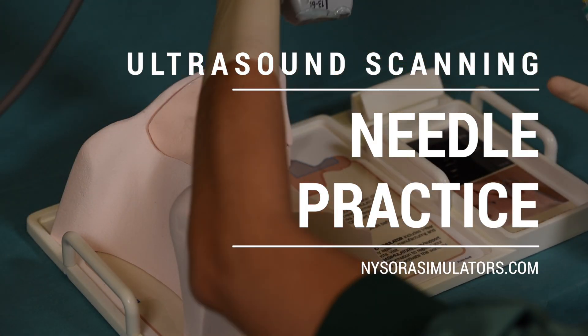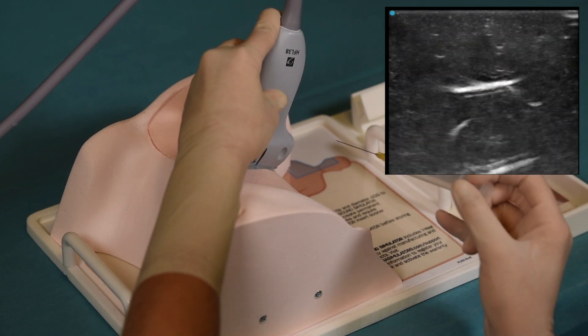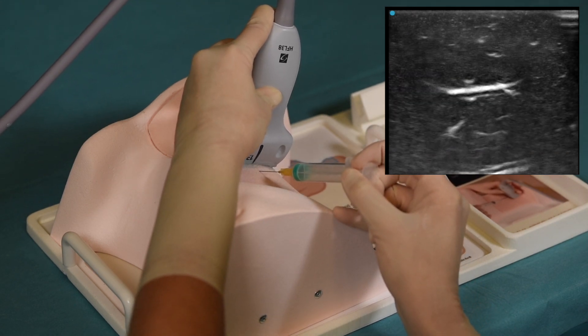Apply a liberal amount of gel on the surface of the simulator. Before commencing needle practice, it is important to increase the ultrasound gain because of the difference in the simulator material and real human tissue.